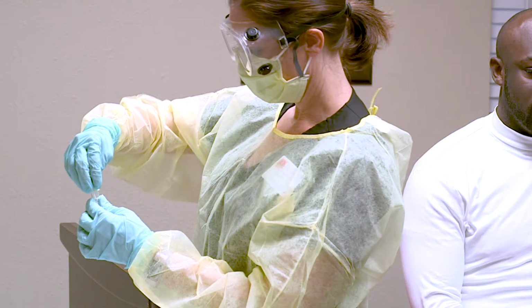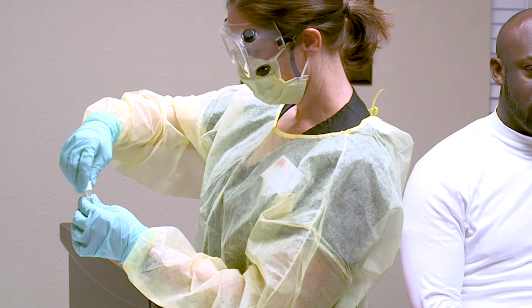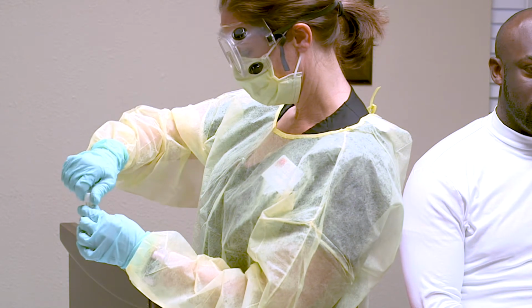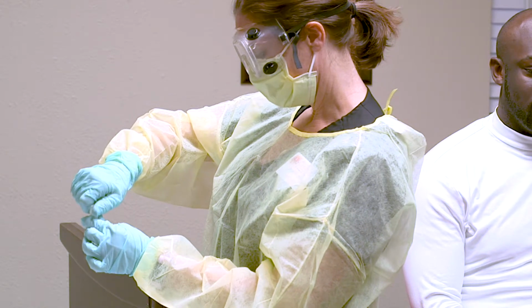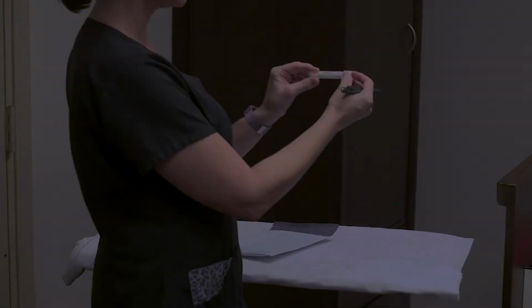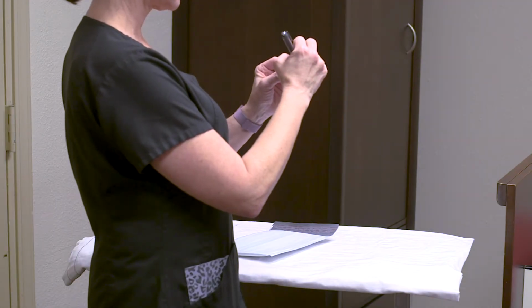If needed, gently rotate the swab shaft to complete the breakage and take away the upper part of the swab shaft. Discard the broken handle part of the swab shaft into an approved medical waste disposal container. Replace the cap on the tube and secure tightly. Write patient information on the tube label or apply a patient identification label.